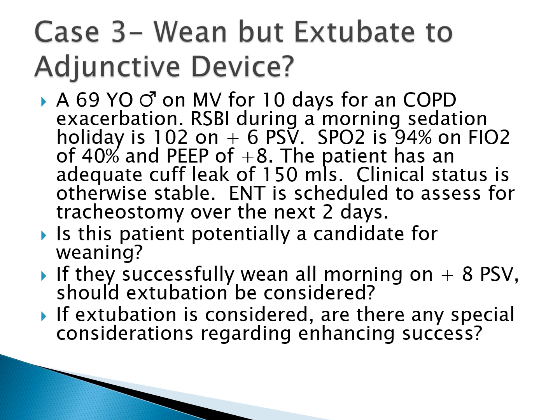So it's like taking an exam with the NBRC. For any nurses in the audience, the NBRC is the National Board for Respiratory Care. They create, sanction, and grade the credentialing exams for respiratory therapists. One rule of thumb, from one of the textbooks that I co-edit: if the NBRC didn't say it, don't assume it's so. So this particular patient, we shouldn't assume that they have a 7 tube in place. They're chugging along on +8 of pressure support.